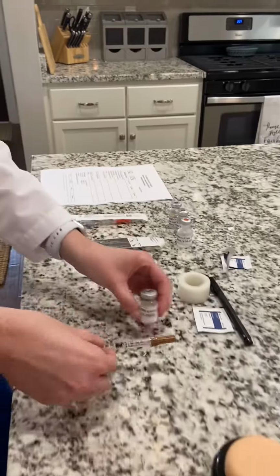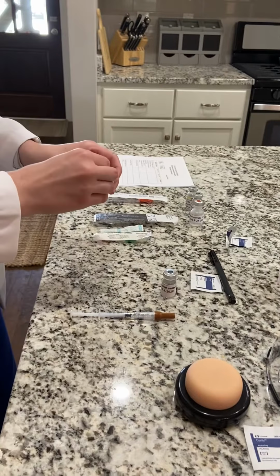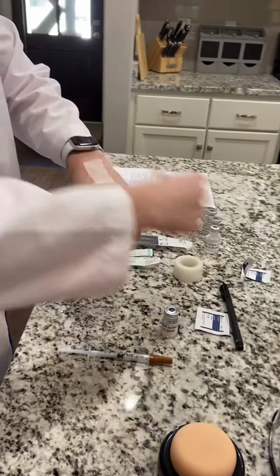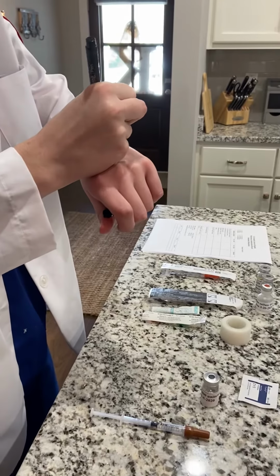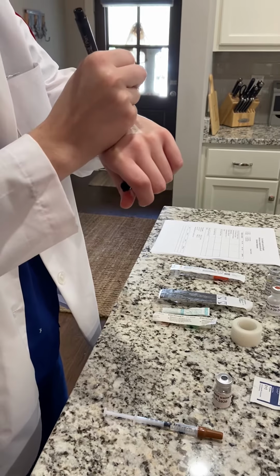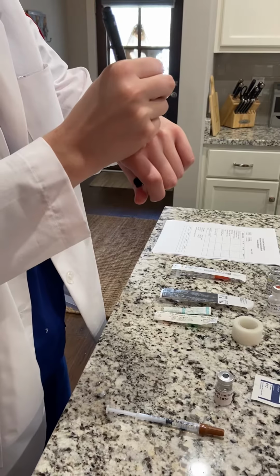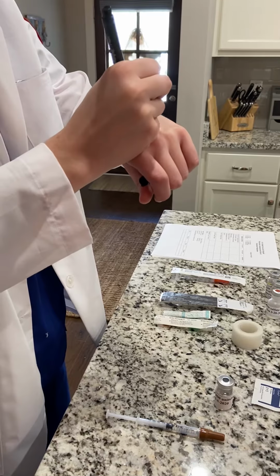Now I'm going to come back over here, and I'm going to label my syringe. On my syringe, I'm going to put heparin, which is ordered 5,000 units subcutaneously, and I'm going to administer 0.5 milliliters at 1200, and my initials.